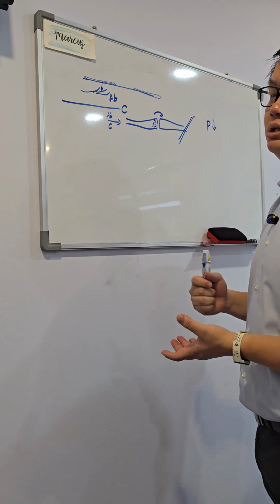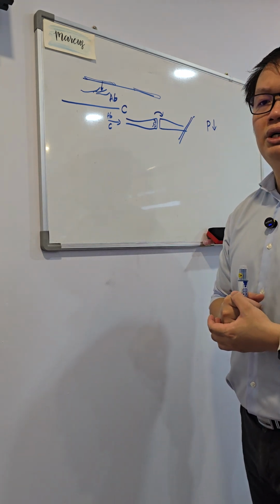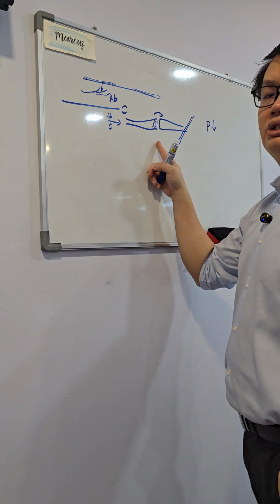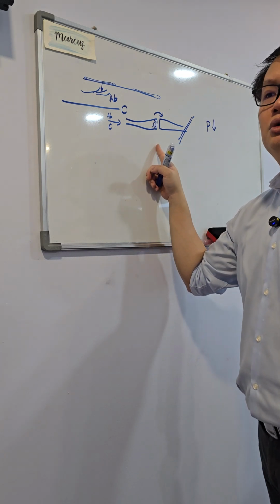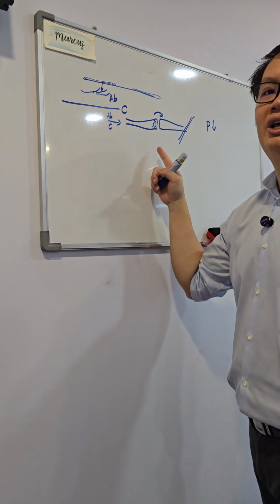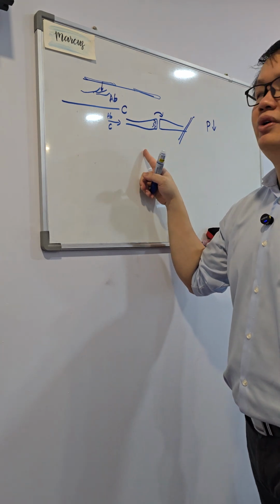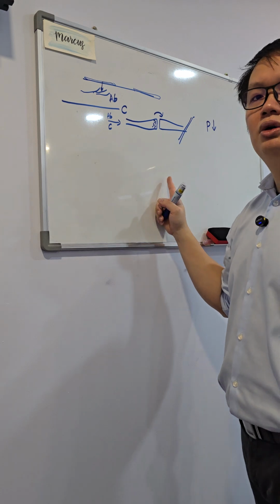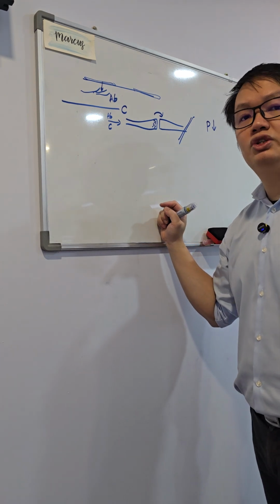But the key that you have to understand is that this is only working at a presynaptic area. So if this is not the cause of their pain and the pathway is not being blocked, then you won't get your desired pain relief results.